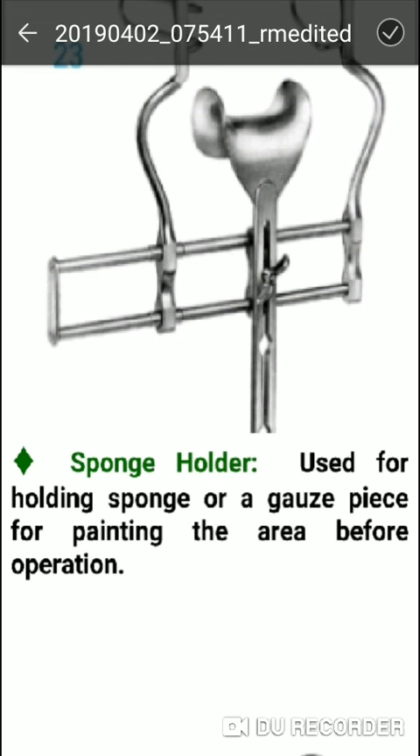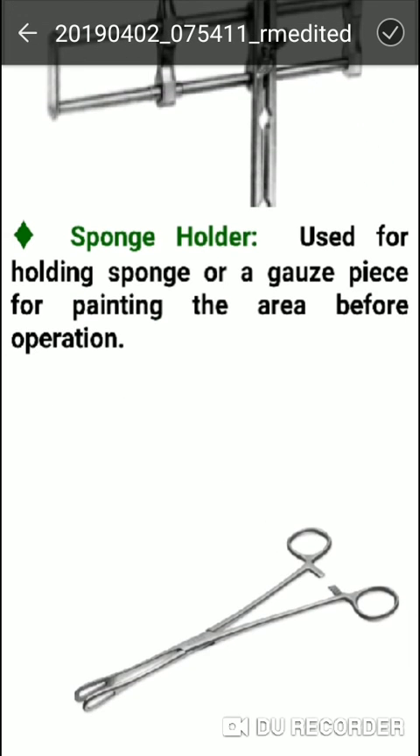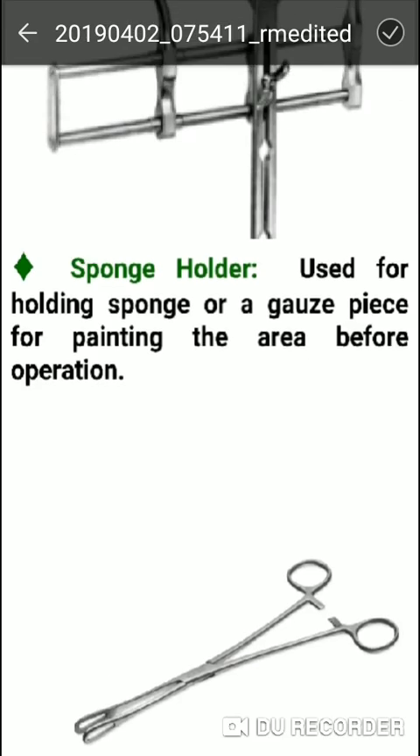The sponge holder is used for holding sponges and for prepping and cleansing the area before the operation.